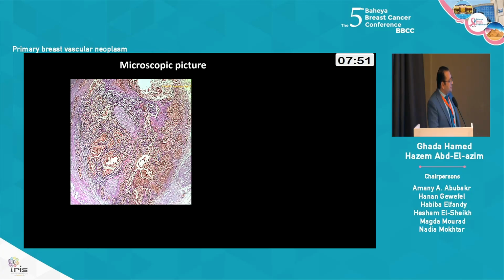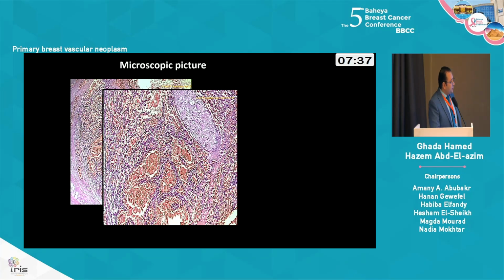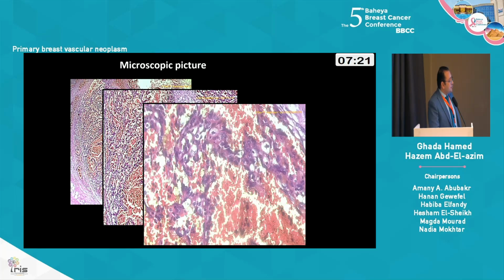Microscopically, there is a multilobulated, infiltrating, highly vascular mass with perineural invasion and infiltration of the soft tissue. Higher power shows anastomosing vascular channels, no solid areas, no frank sarcomatous areas. These vascular spaces are filled by RBCs, not well formed. There is scaffolding, there is no necrosis. The higher power shows the ugly face of these cells, showing hyperchromasia, increased N/C ratio, increased mitosis, and other malignant features.